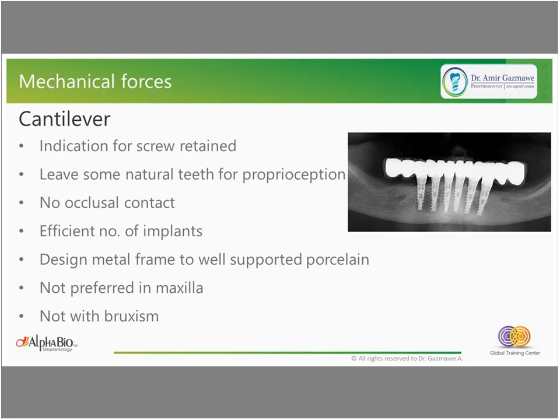So in order not to lose the retention of the restoration and to have the forces on all the implants as much equal as possible, the screw-retained restoration can be a good choice in most of these cases.